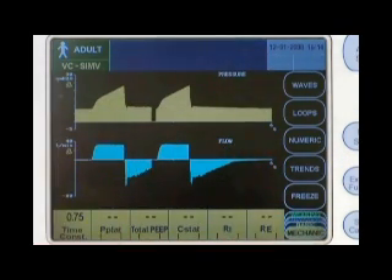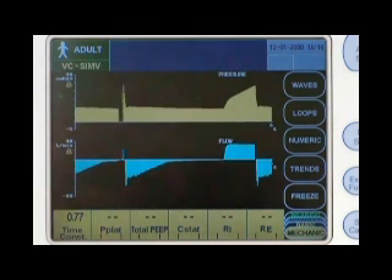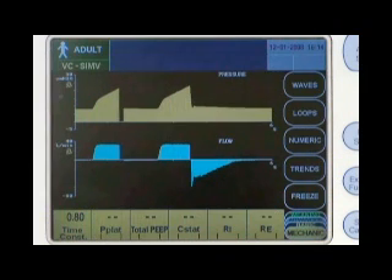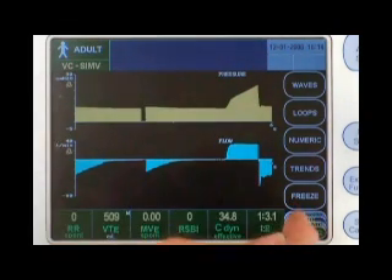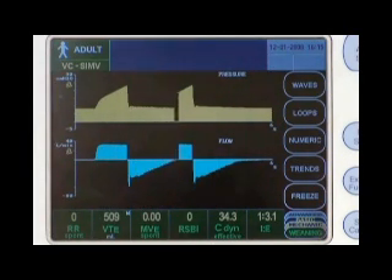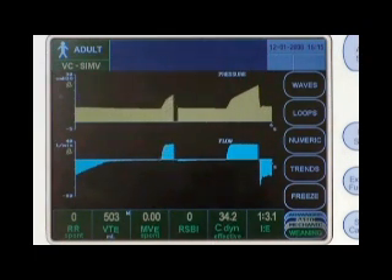The mechanics data set allows you to view the time constant, plateau pressure, total PEEP, static compliance, inspiratory resistance, and expiratory resistance values. Maneuver-based values are time-stamped with the time that the measurement was made. The weaning data set allows you to view spontaneous respiratory rate, exhaled tidal volume, spontaneous minute volume, rapid shallow breathing index, dynamic effective compliance, and IE ratio.